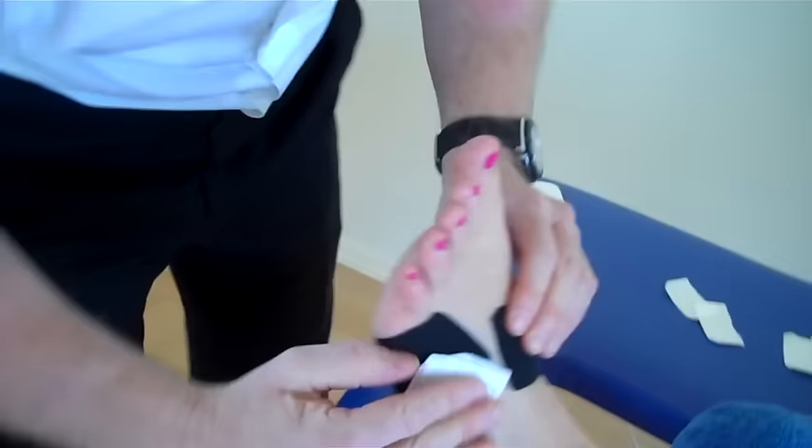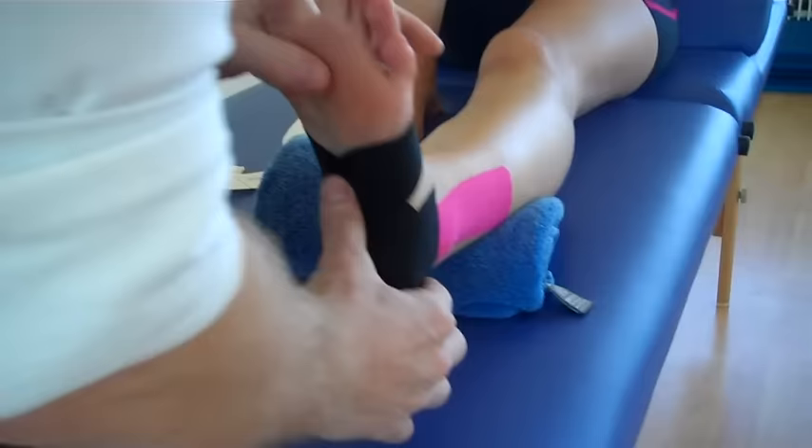This taping technique is for an ankle inversion sprain using three eye strips. For further information on taping, you can look at johngibbonsbodymaster.co.uk.